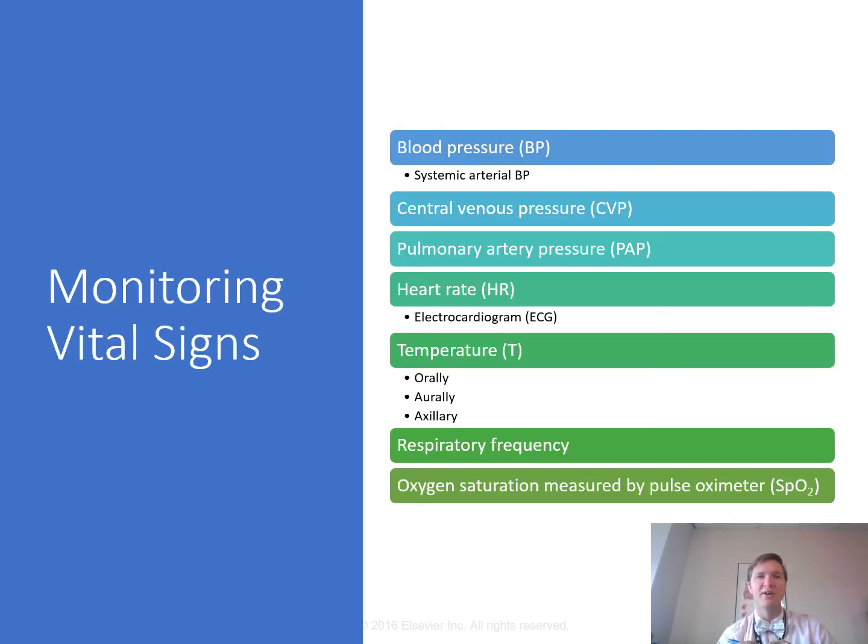All right, so monitoring vital signs. Observing and recording vital signs are going to be very important every time we go in there. Heart rate, patient's temperature, circuit temperature, right? So temperature on both machine and the patient. Breathing rate, oxygen saturation measured by pulse oximetry, their physical appearance. All these things really do help staff members evaluate for possible changes in their overall condition.